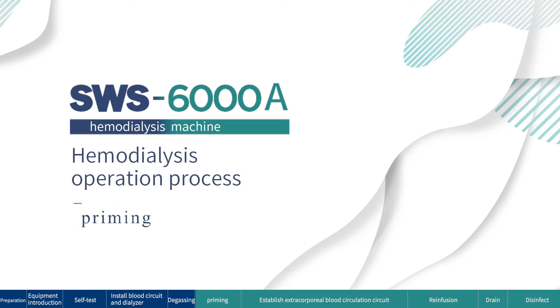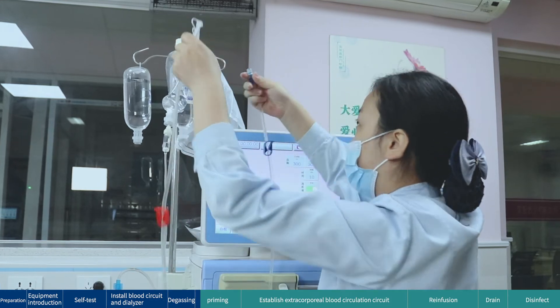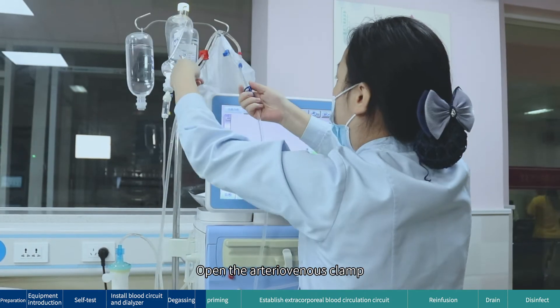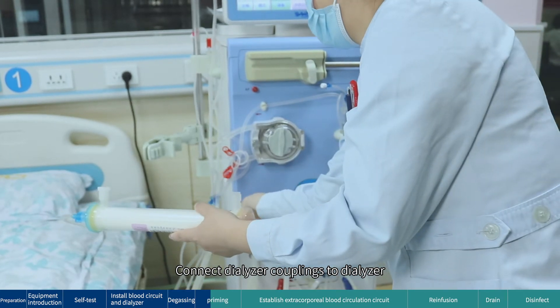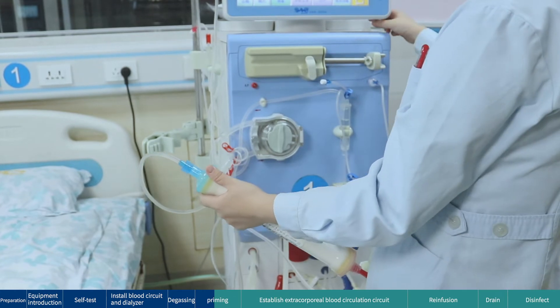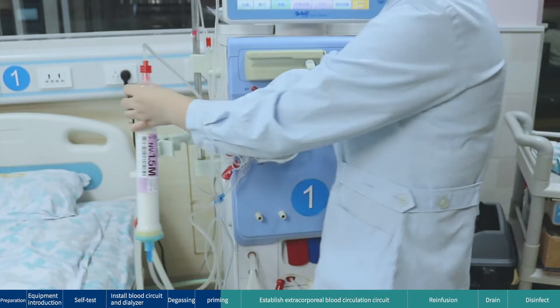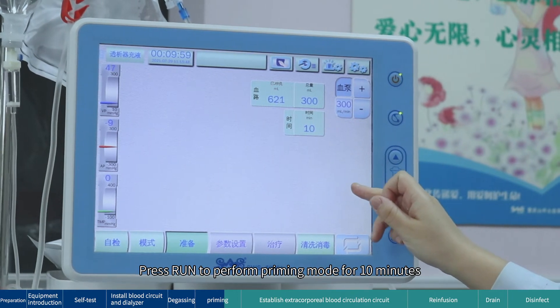Continue priming. After the blood pump stops, connect the arterial and venous blood circuits together and open the arteriovenous clamp. Connect the dialyzer couplings to the dialyzer, noting the color of the connections. Put the venous port of the dialyzer facing down. Press Run to perform priming mode for 10 minutes.